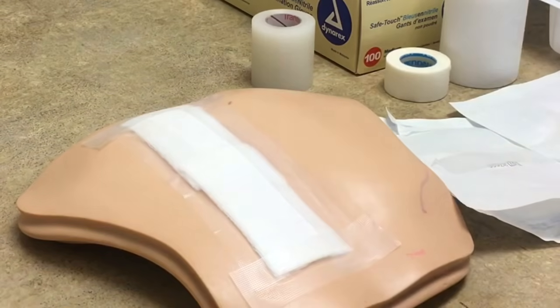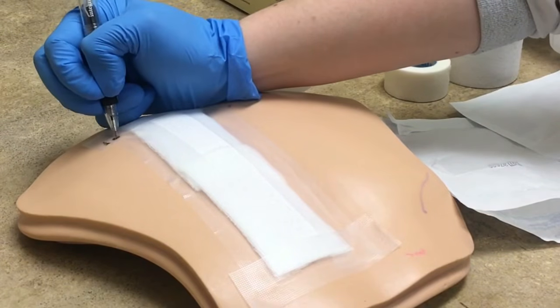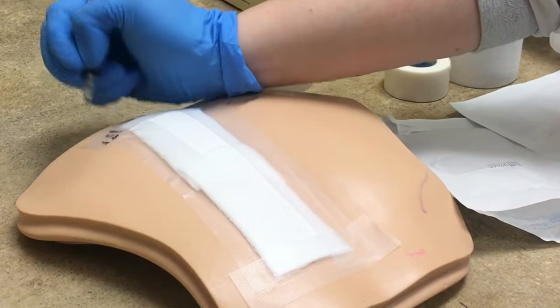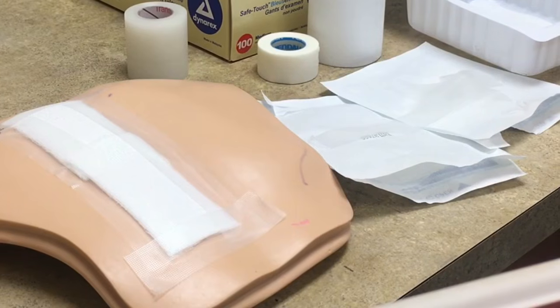And from here, again, like we said, we will date it, time it, and initial it. And then we will remove our gloves and dispose of them appropriately. And since we don't have any blood, we can put them in the trash can, along with all of the trash that we have accumulated throughout this dressing change process. And we will again perform hand hygiene.